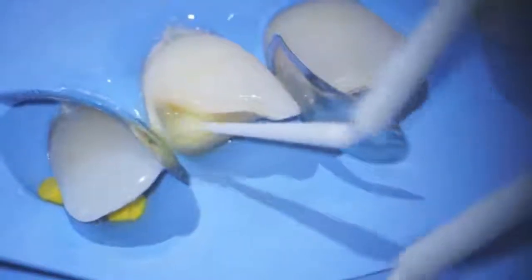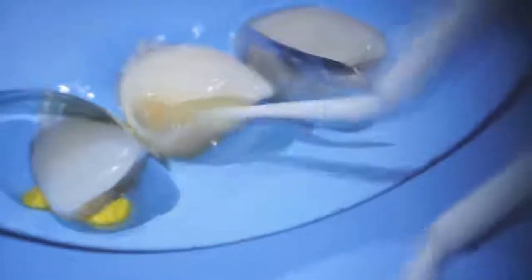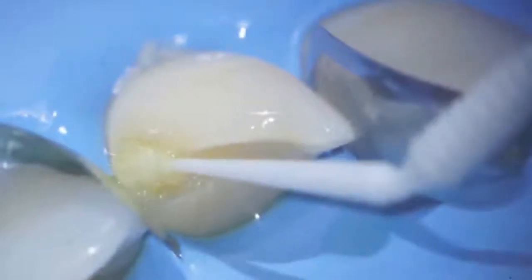The stage of application of the adhesive system. I prefer OptiBond FL of the fourth generation, and here you can see the application of the first bottle, the primer for dentin. Usually I apply the primer a few times with thorough mechanical activation with a micro brush, in order to form a deeper hybrid layer on dental tissues.